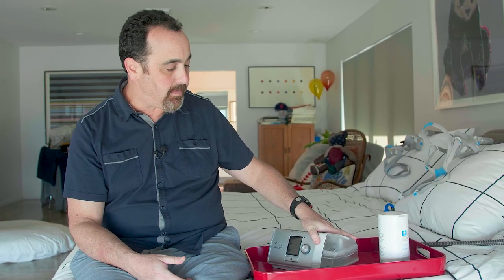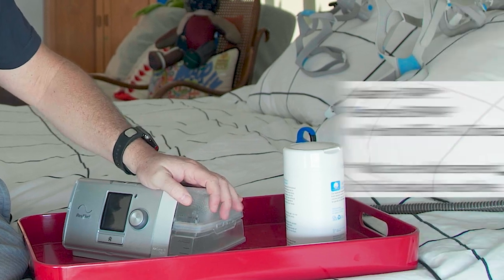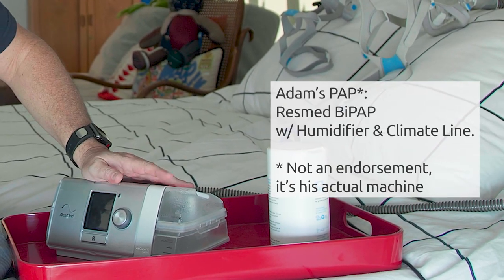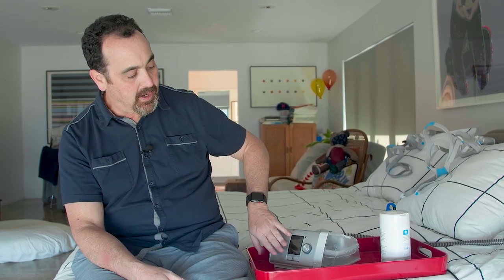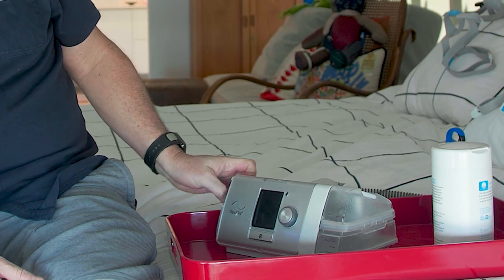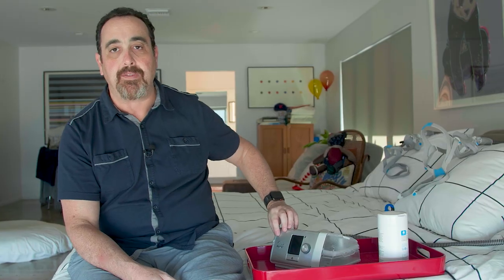Right now I'm using a ResMed BiPAP machine with a humidifier and a climate line. My fixed pressure on inspiration is 18 and my fixed pressure on expiration is about 14, and so far that's been the best therapy intervention for me. I can look at my summary data on the machine, via the SD card that's built in, or via the cellular chip that uploads my data every morning to ResMed's MyAir app.